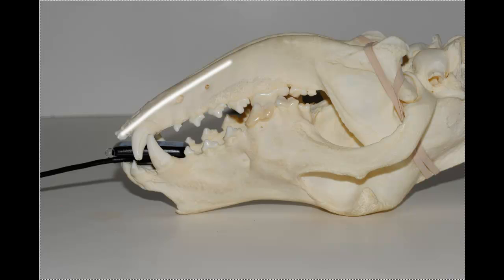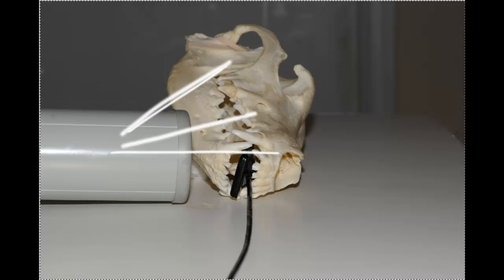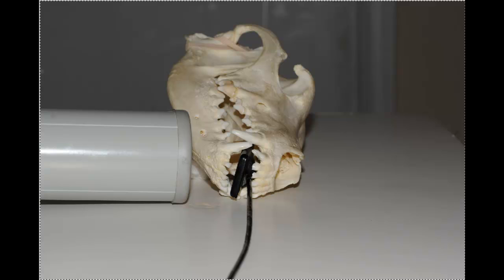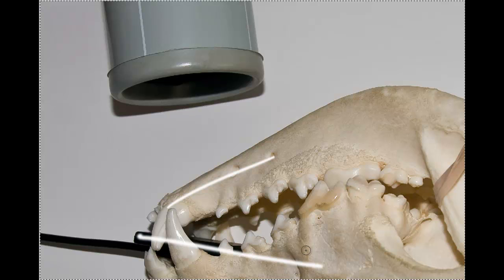And for the mandibular teeth, we have a much more acute angle. Here's a sensor, there's the teeth. The bisect would be approximately there. And there we have that. Now normally, with a dog this size, you're actually going to be taking it like this. Well, here we are at the front, so we can't really see the angle of this shot. So if we look straight down from above, straight down from that angle, we then see that, again, there's the teeth, and there's the sensor, and there we are roughly parallel to that.